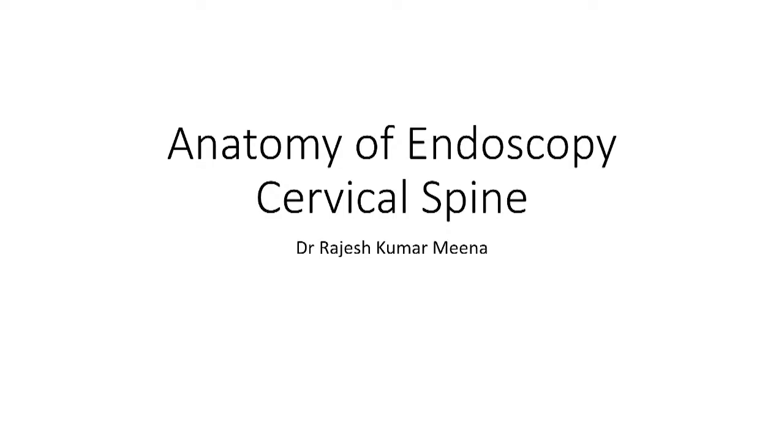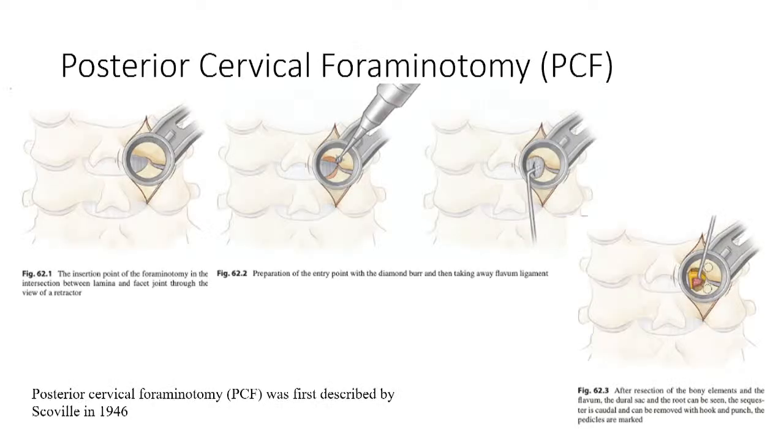Thank you. Like yesterday, when I talked about the endoscopic anatomy of the lumbar spine, today I will be talking about the endoscopic anatomy of the cervical spine. So the talk is only for the endoscopic approaches of the cervical spine. It is not a comprehensive talk.